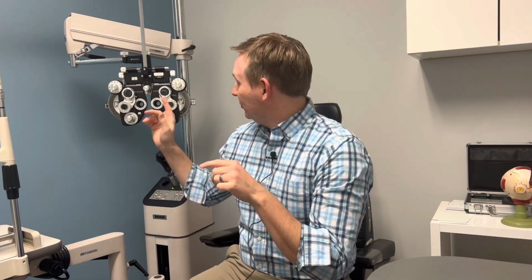Hey y'all, Dr. Walley here, and today's video should be a very popular video because I am going to talk about refractions. And the first question you may ask, what is a refraction? So a refraction is when we use this machine here that's called a Phoropter, and that's how we figure out what your glasses prescription is.